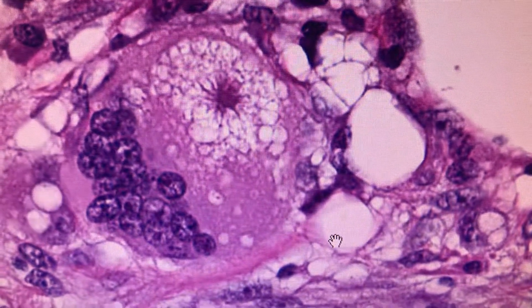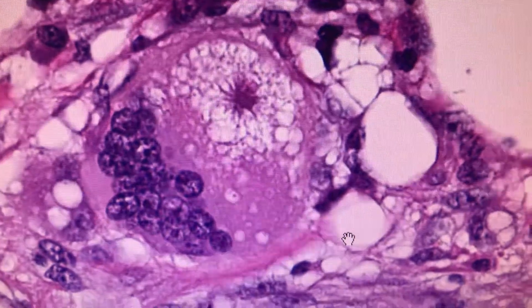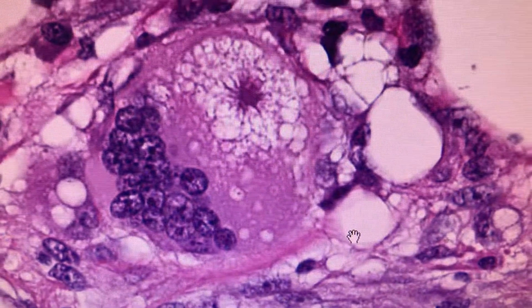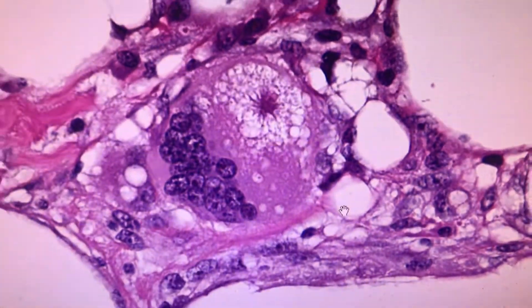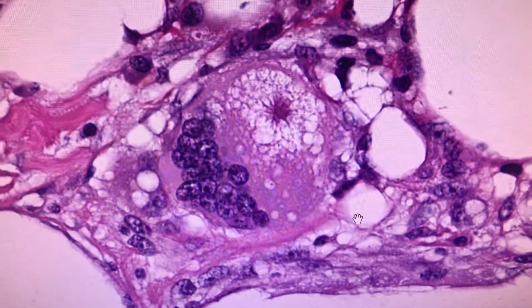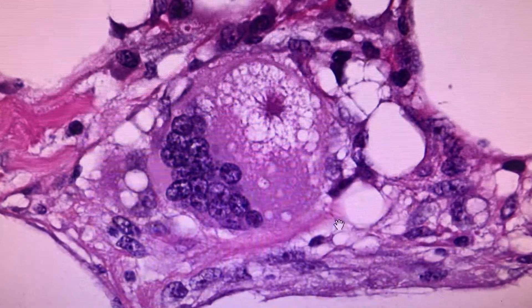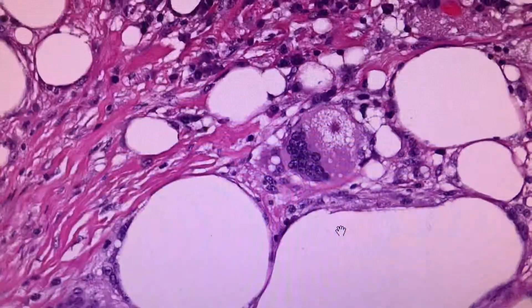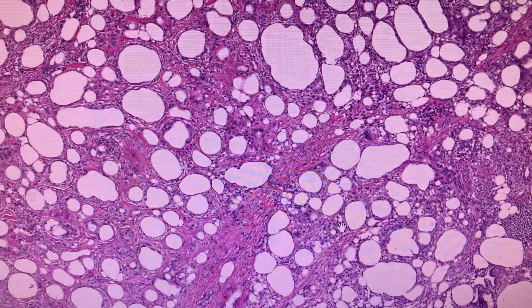Hi guys. Dr. Yale Rosen often says that asteroid bodies are actually more common in foreign body granulomas than in sarcoidosis, and I wanted to show you a case that illustrates just that. Here's a beautiful big multi-nucleated giant cell with an asteroid body, and you might think, hey, asteroid body must be sarcoidosis — but just back up a little bit and let's see if you can make this diagnosis.